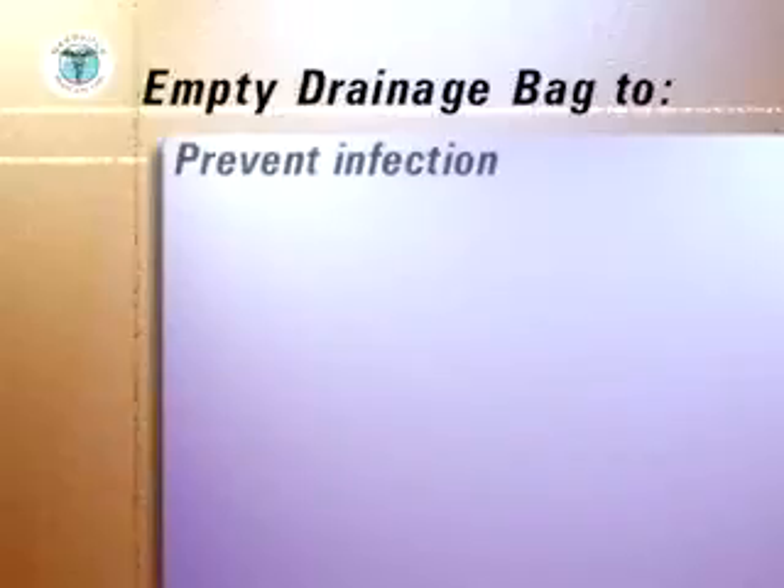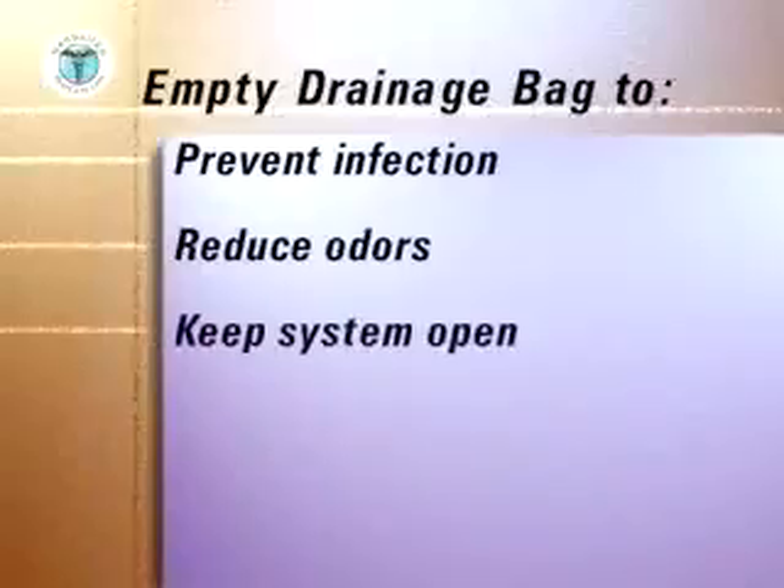The drainage bag should be emptied at least daily, more often if it fills, in order to prevent infection in the system, reduce odors, and keep the system open and flowing.